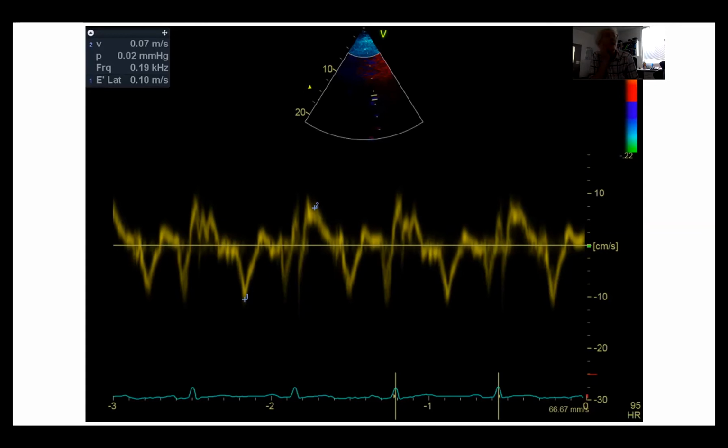Yeah. So we have hypotension plus acute kidney injury. Yes, on the day before this was taken. Yes, and a lady that has likely an autoimmune disease and some inflammatory pericardial effusion. Is she on any treatment already, or what is the progression? So she likely needs probably a diagnostic tap at least. Yeah, I'm going to move on to that when we finish the echo.